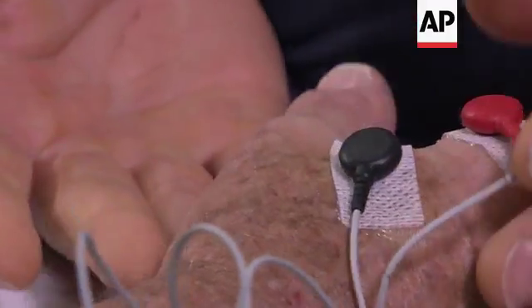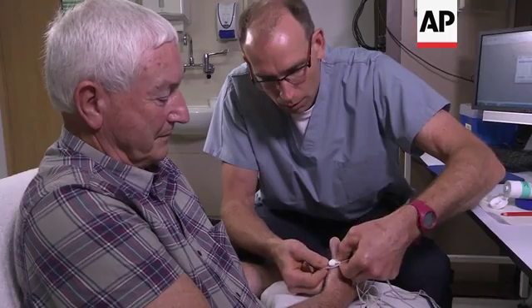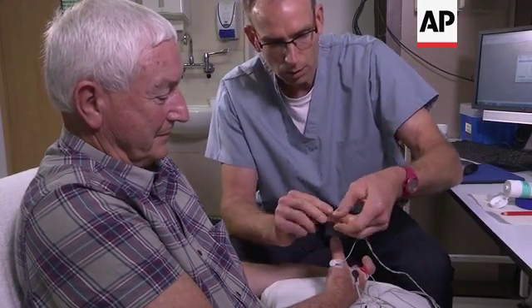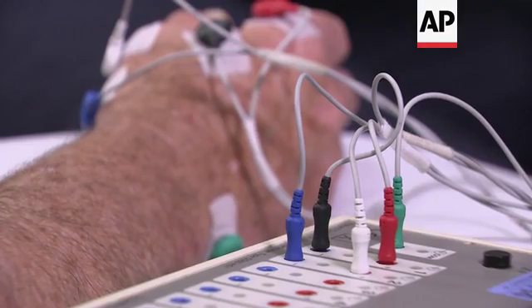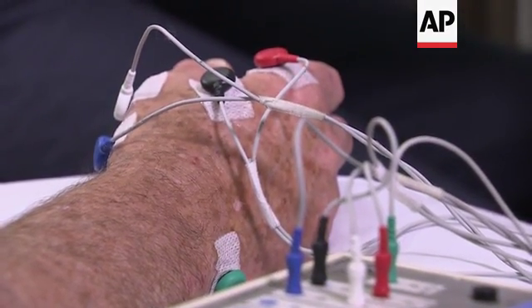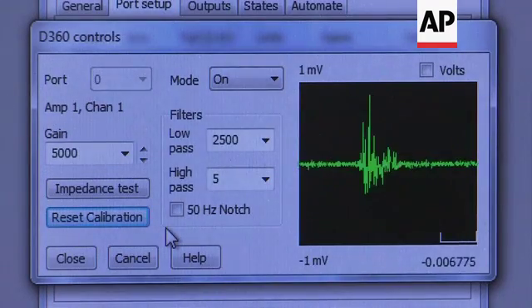Okay, and if you just turn your hand, so we just... Okay, so now you turn your hand here, we just got to put one here. Yeah, I'll do one a second.